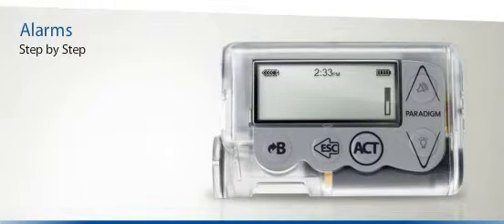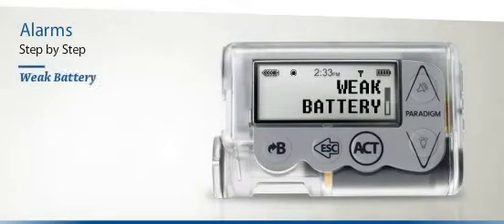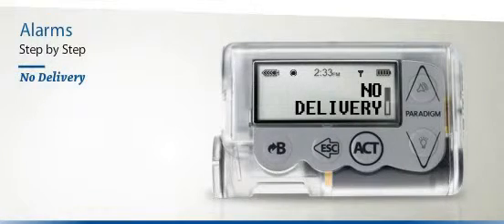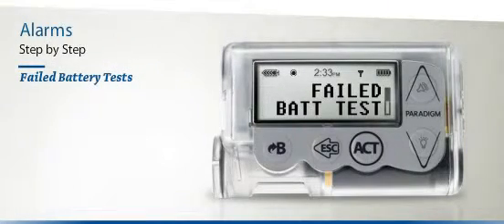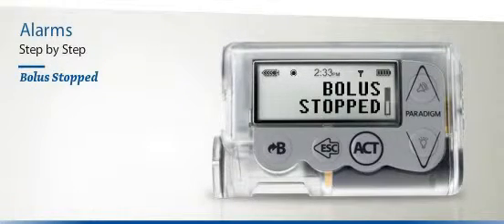The Paradigm Veo will issue a number of different alarms, and you must always press Act to find out what the problem is. Empty Reservoir means you need to change your reservoir immediately. Weak Battery means you need to change the Paradigm Veo's battery immediately. No Delivery means that insulin is not being delivered through your infusion set — check your blood glucose, check for ketones, and change your infusion set and reservoir immediately. Failed Battery Tests means you need to install a new battery. Bolus Stopped means the bolus was stopped mid-delivery; reprogram your bolus with the amount that was not delivered.